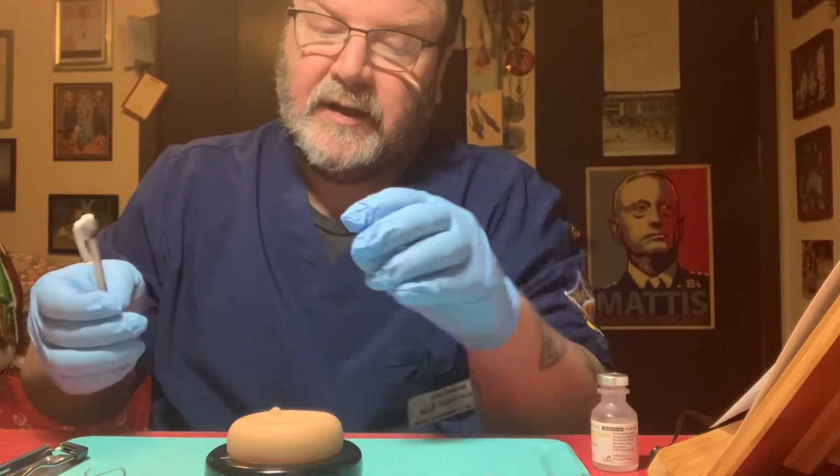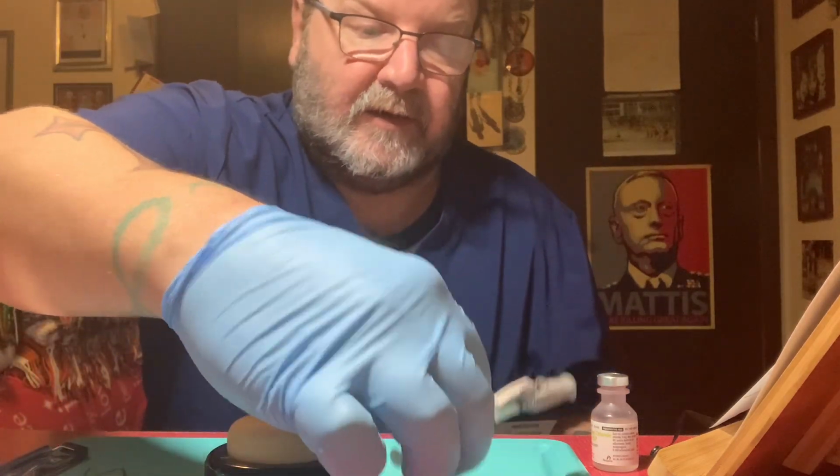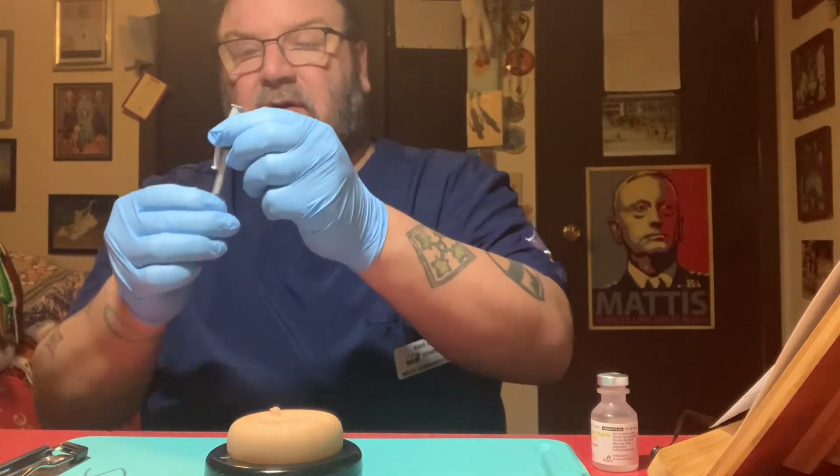Remove the medication. I would put this in a Sharps right now without recapping it. If the Sharps was available, if I had to go across the room, I would, of course, recap it. For safety purposes in my home, I am going to recap it using the one-hand scoop, grasping it low for safety. Then, if I needed to, I would take a gauze pad and place it on the wheel, not rubbing or pushing, of course, but just placing it on the wheel if I needed to.